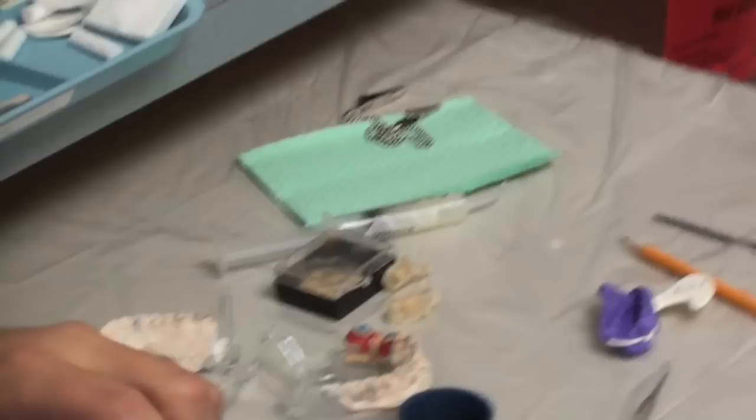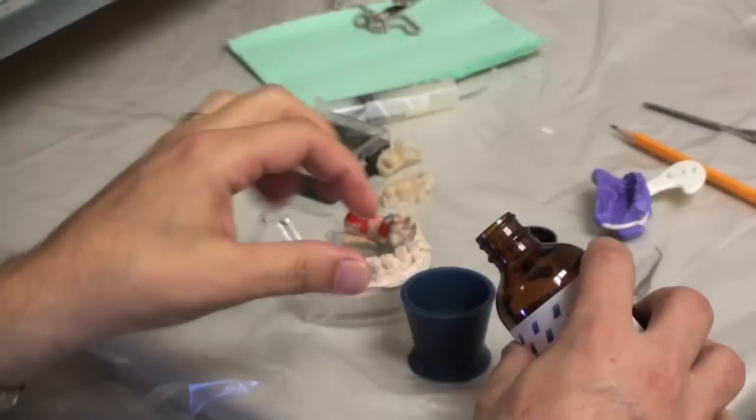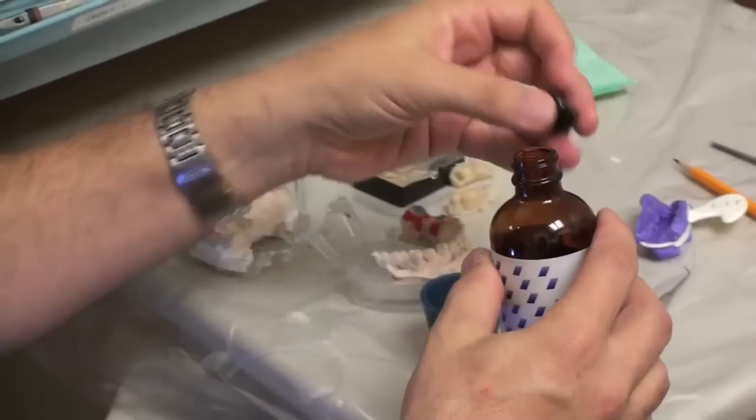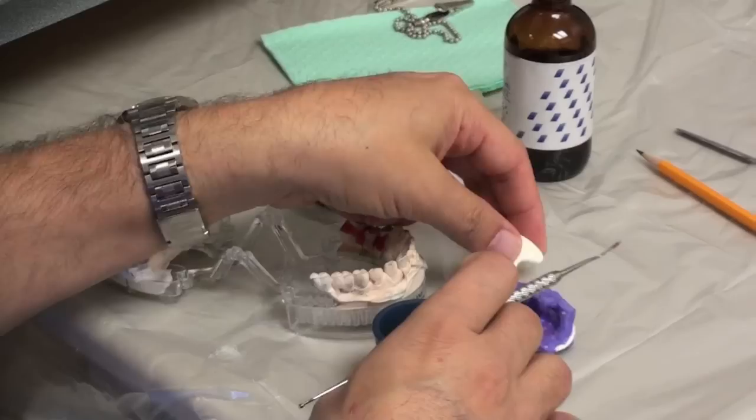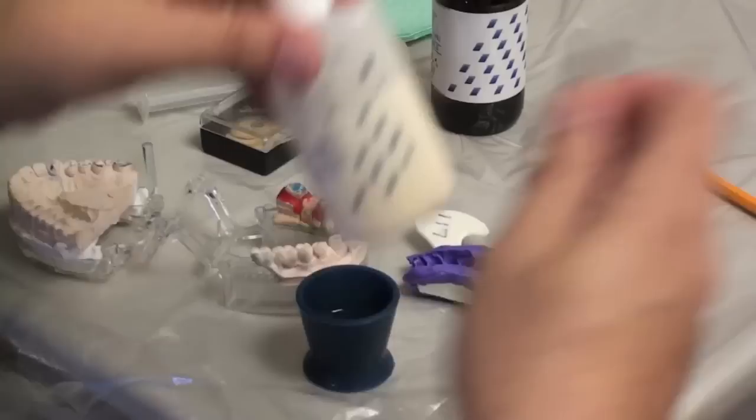First thing I'm going to do is mix some acrylic. Now there are different ways of doing this. There's the salt and pepper technique where you're placing the powder and the liquid directly into this impression. I like to do it in a mixing dish — I just think it's faster, but both ways can work.